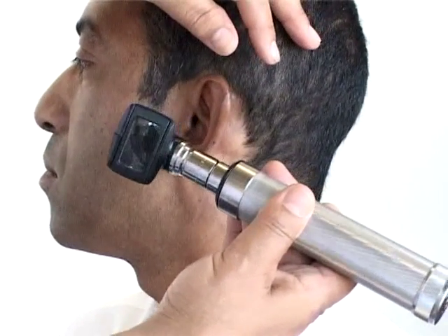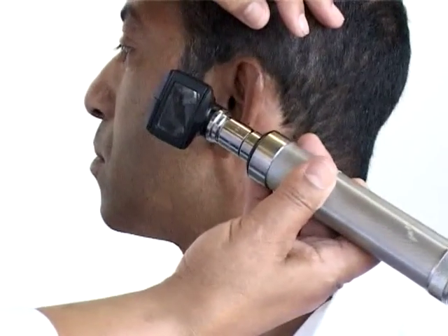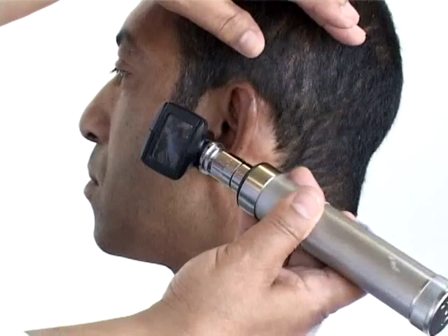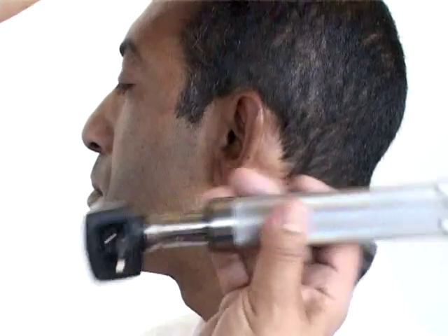I'm going to put the otoscope in your ear just to ensure that I can see everything properly. This is the way you hold the otoscope — remember it's all in the wrist.